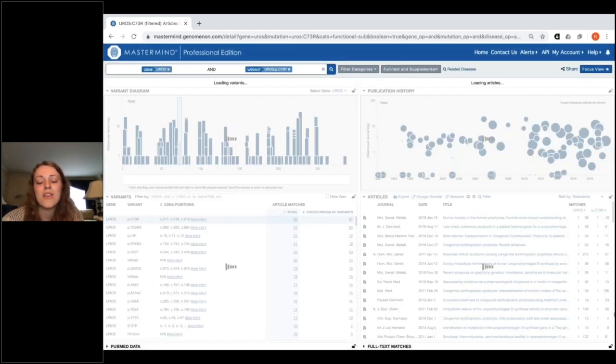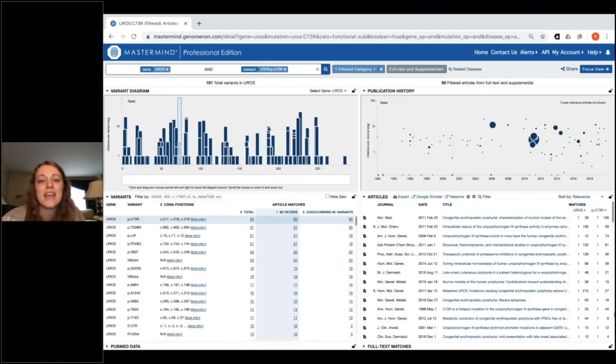And once we submit, the relevance of journal articles will change. And so for this example, there has been a dramatic change in journal article relevance, and the article segment in the bottom right has also changed in accordance with the relevance of journals, including the filtered key terms.